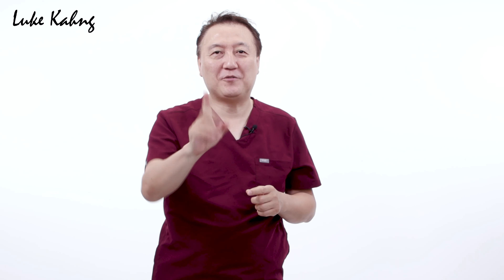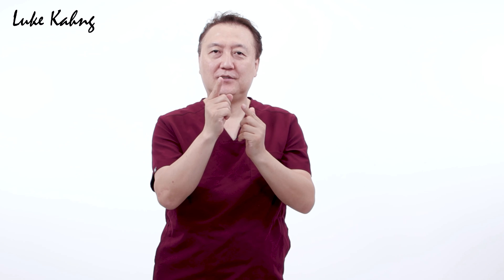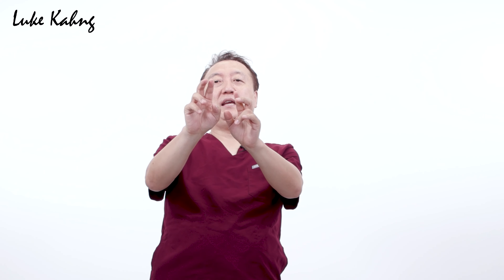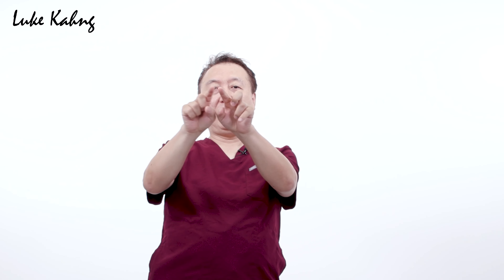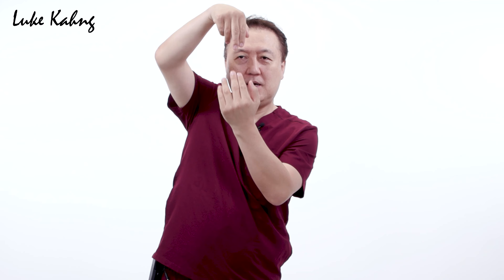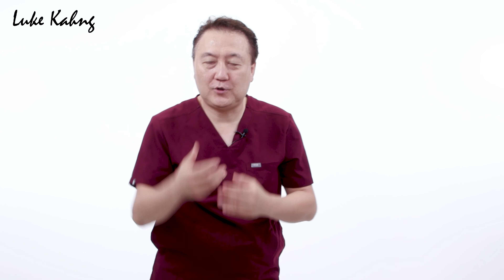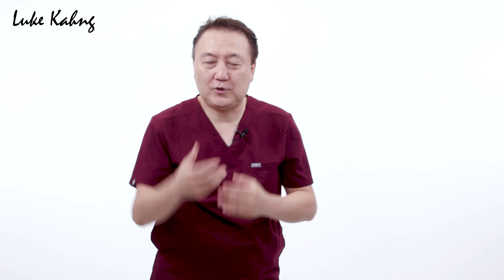For this case we made a flexi partial. It was a little tight so we ground it and matched it — clear color — very comfortable. The key reason we made a small partial is that it's provisional, not long-term, because there's an implant inside. Maximum six to seven months, and after that we have to change to the six-unit case.